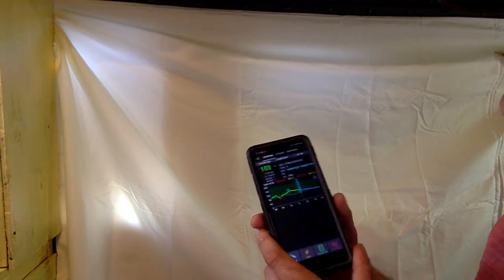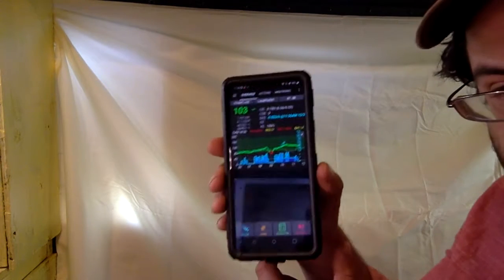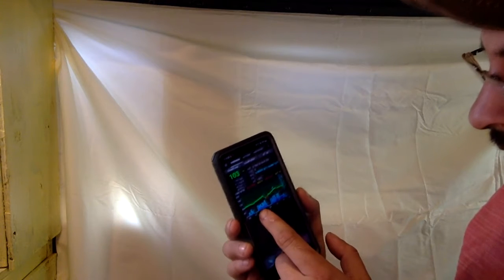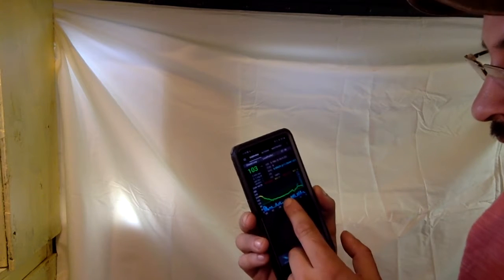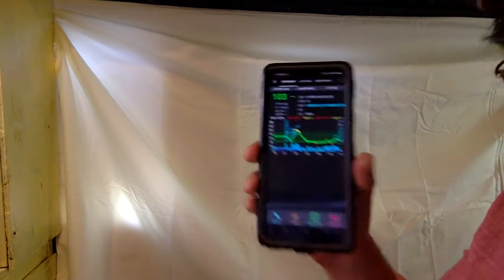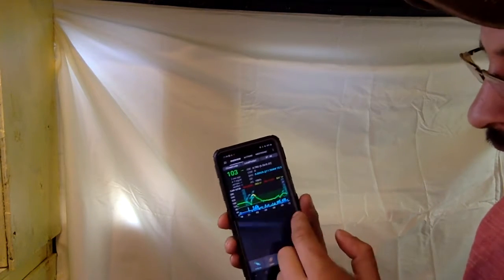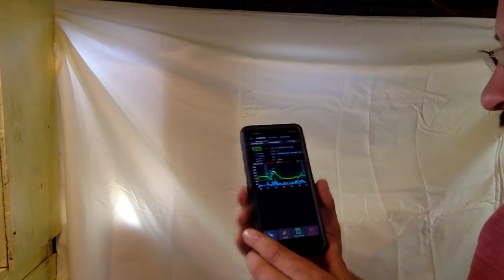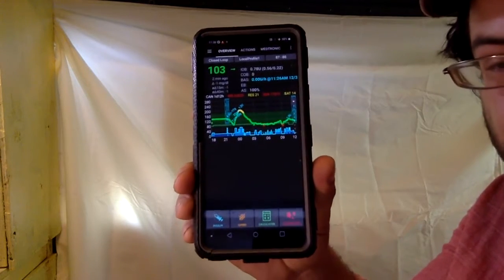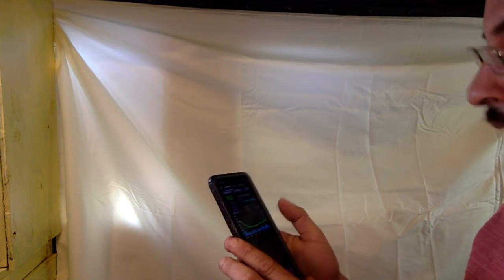If I add my prediction, that's what is expected to happen. If I add my basal, I can see that at 7 in the morning, AndroidAPS had to suspend my basal. So, you can see that I was high. My dinner made me go high and it came low. So maybe that's why it was suspending my basal. And it did do a great job keeping me flat, so you'd think, well, that's really good. But actually, this is a problem here. All those suspensions of the basal throughout the night might mean that my basal is too high.